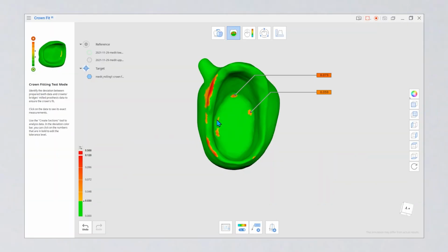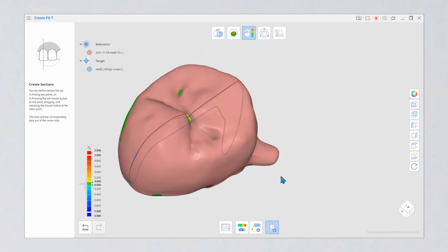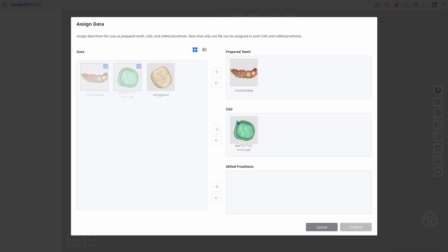Medit Crown Fit is an app that helps to perform a digital crown fitting test by checking the alignment between prepared teeth and milled prosthesis data in just a few steps. To use the Medit Crown Fit app, you need 3 pieces of data.